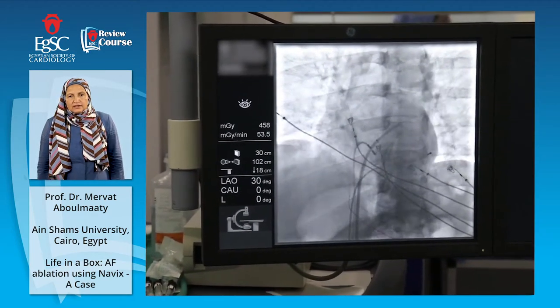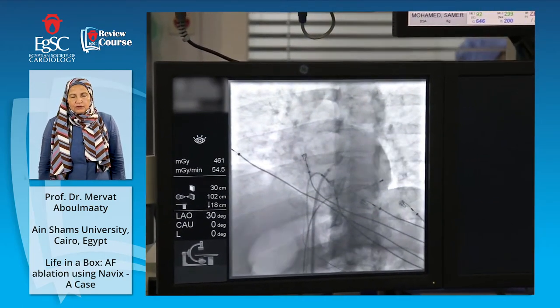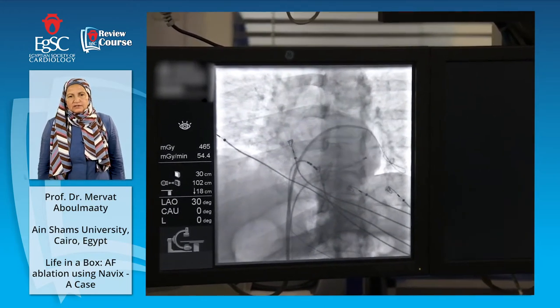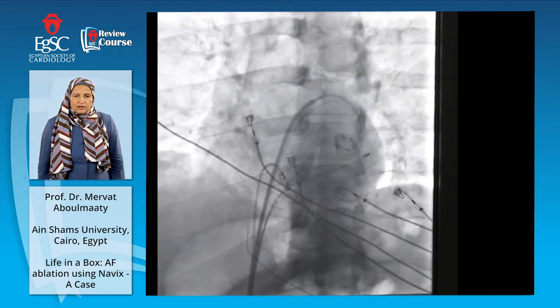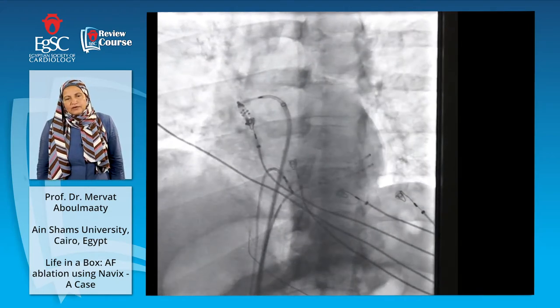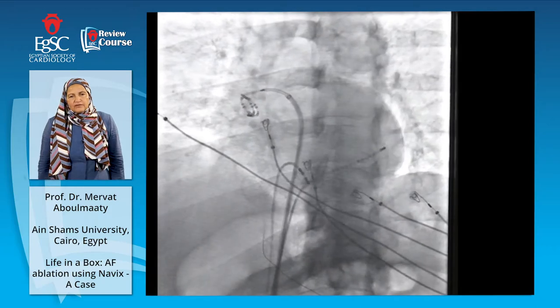Yes, we'll take out the needle and we'll insert a guide wire into the left superior pulmonary vein, yes, into this one, into the left inferior. The sheath is delivered over the dilator. And then we'll place the circular decapolar catheter into one of the veins.